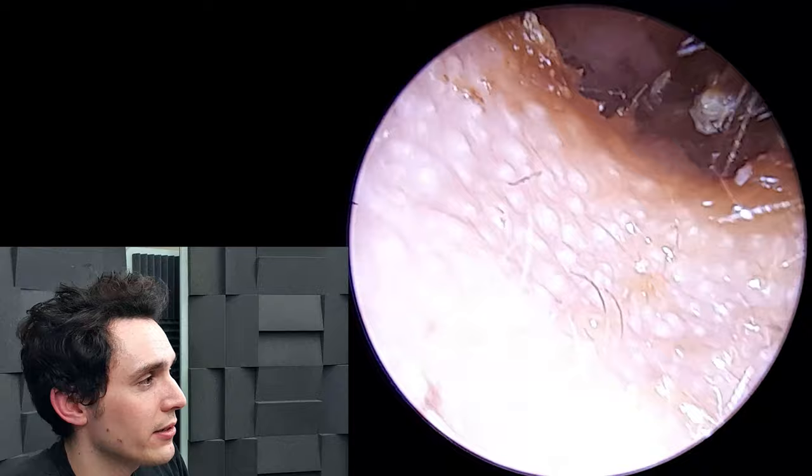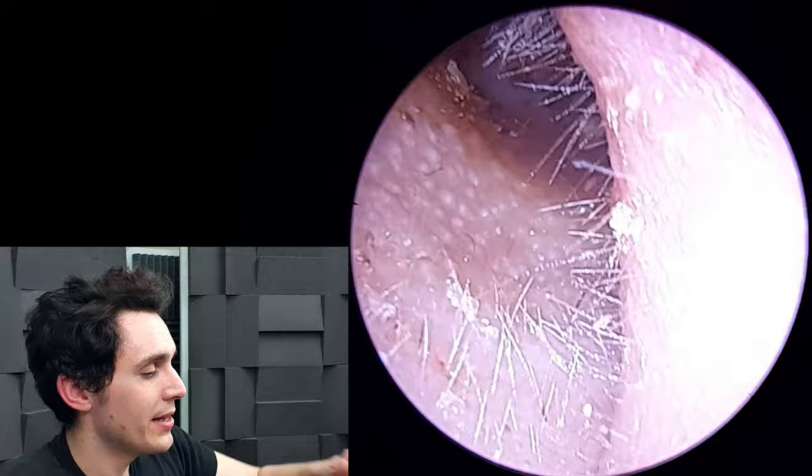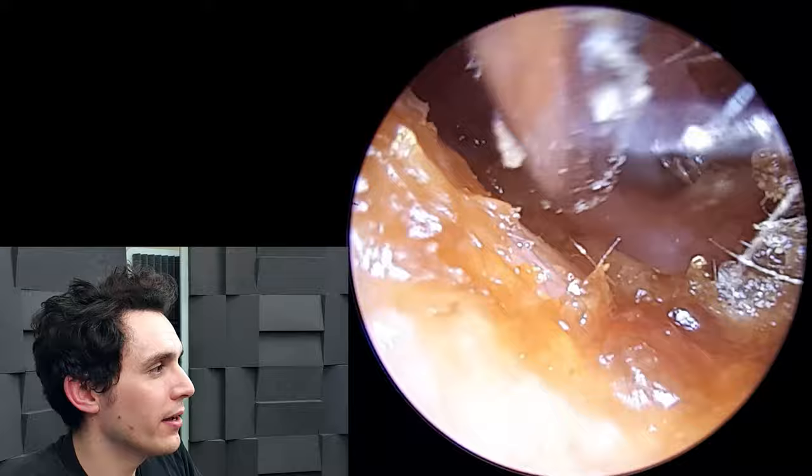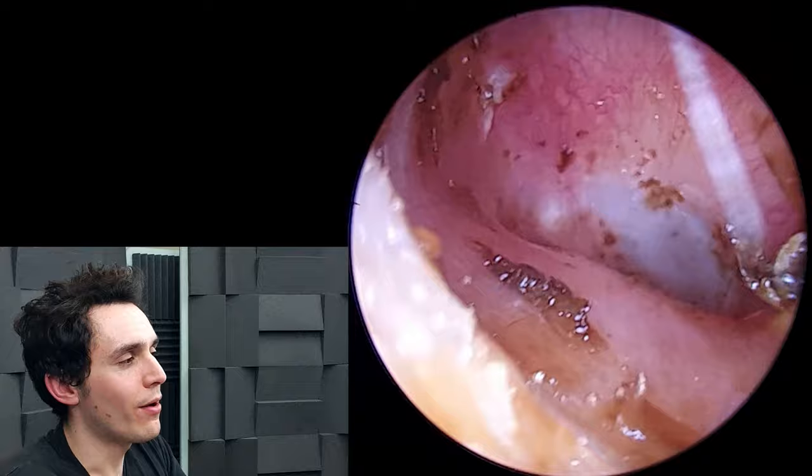Now let's take a good look at the eardrum. The eardrum is actually obscured by a sort of hill — so you can understand why it was able to hide such a huge amount of wax. There's that grey skin in the background — we'll just mop up and then get a better look.